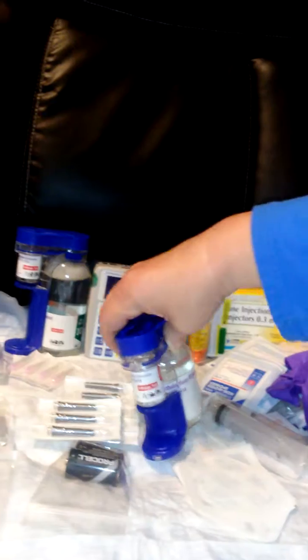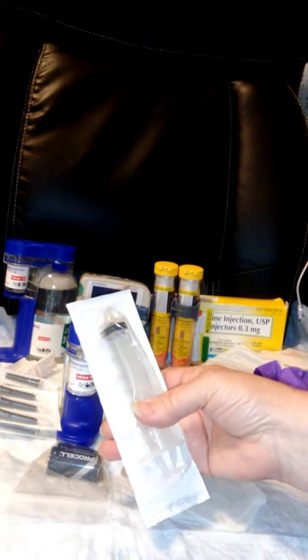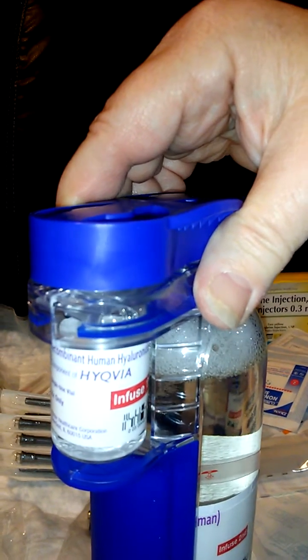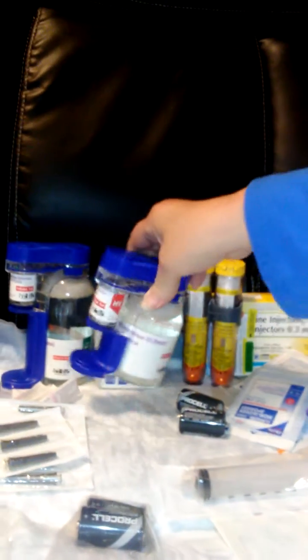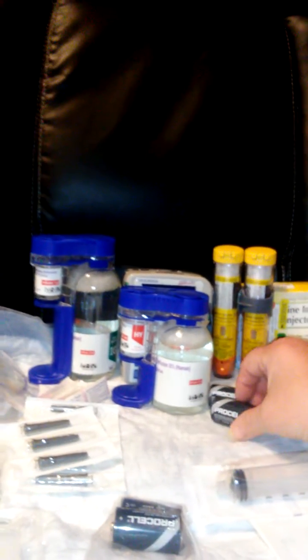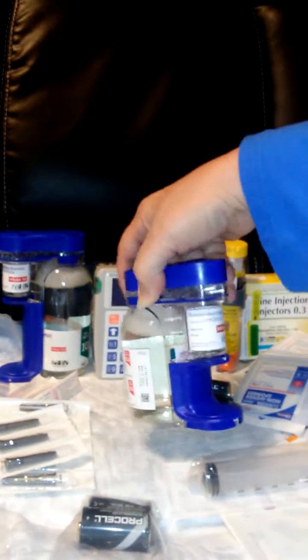So the first two little bottles need to be taken out of this with the syringe. And both these small bottles, the high part of HyQvia, is injected into my thigh to prepare my soft tissue to absorb this portion of the infusion, or as we call it, liquid gold. If you have CVID or hypogammaglobulinemia, that is why I'm called a zebra.